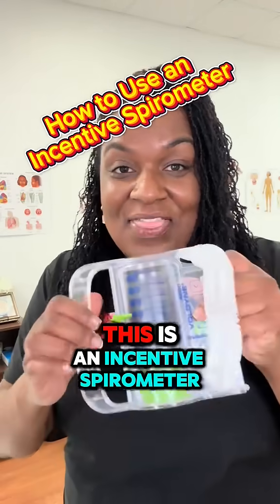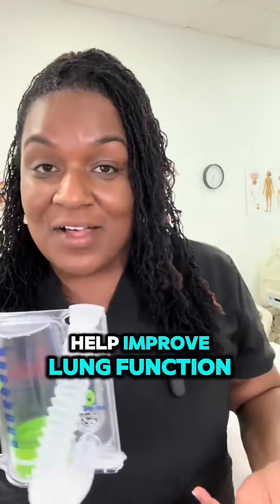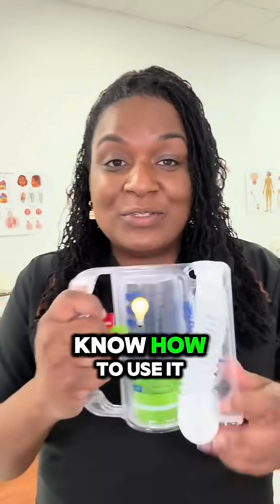Do you know what this is? This is an incentive spirometer. It is used to help improve lung function. Do you know how to use it?